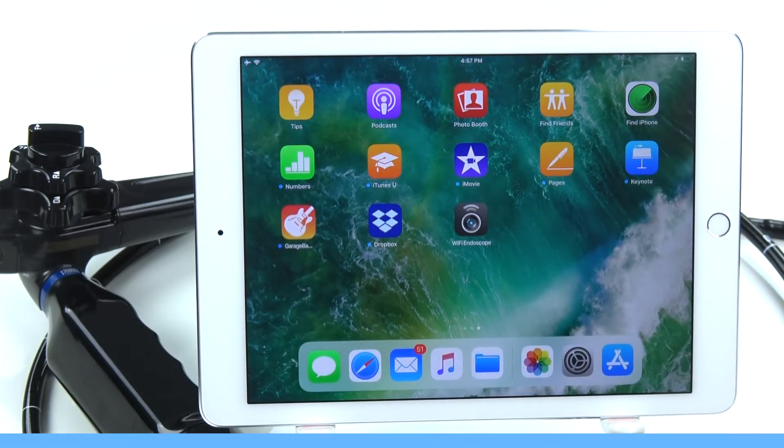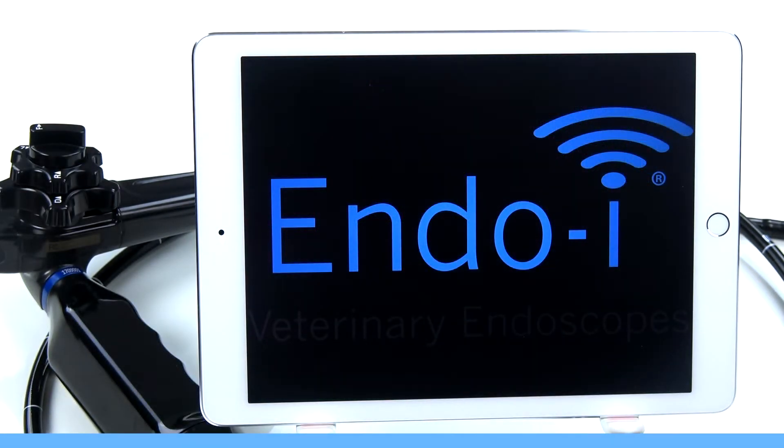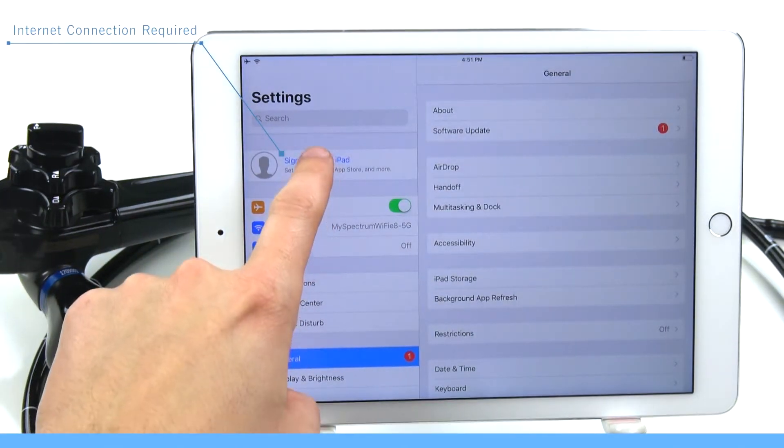Now we need to download the Wi-Fi Endoscope app onto the included tablet computer. To download applications onto the tablet, you'll need to log in with an Apple account. On your tablet, go to Settings and log in with your Apple ID.